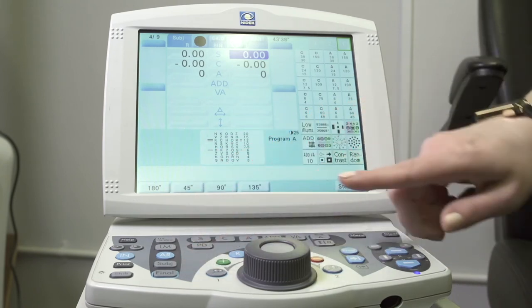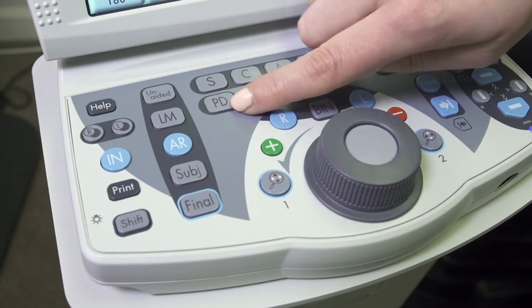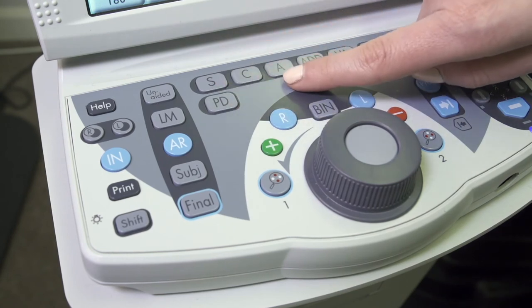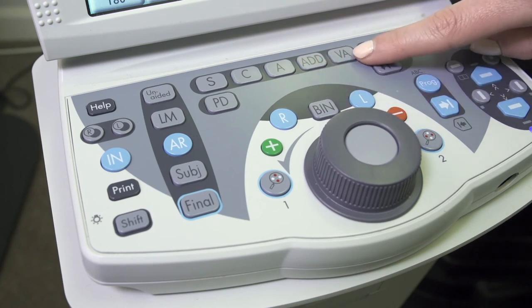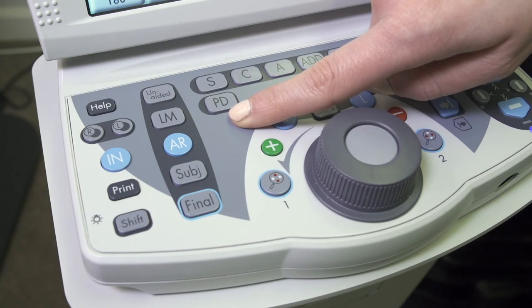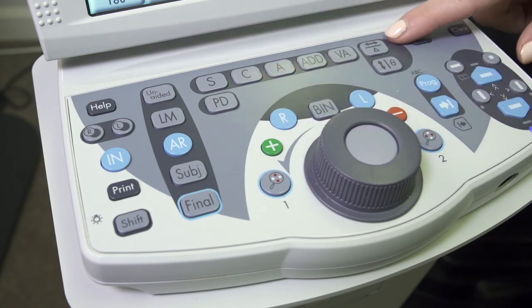At the top half of the panel just here, we're able to change between sphere, cylinder, axis, add, and visual acuity measurements, as well as the ability to measure the patient's PD. We're also able to add in vertical and horizontal prism as required.